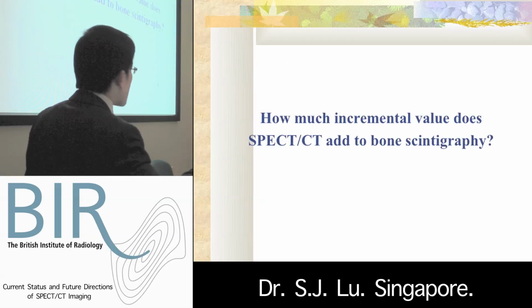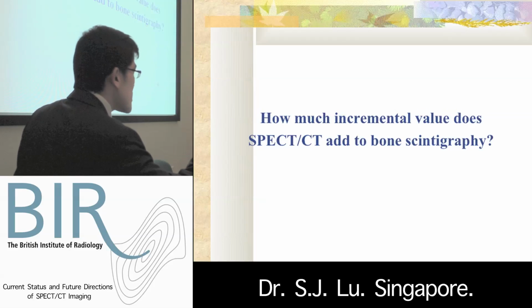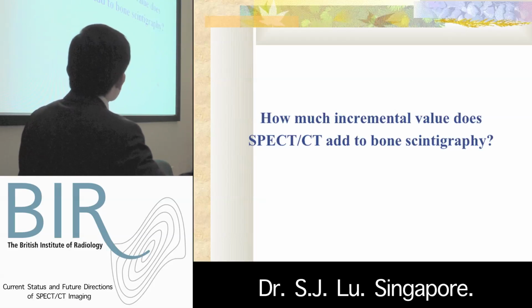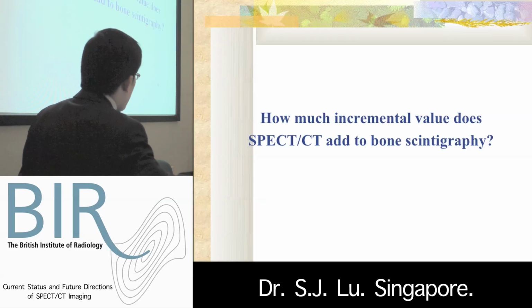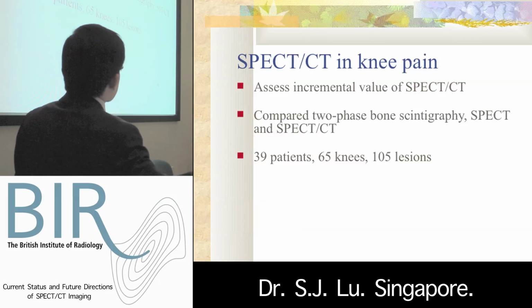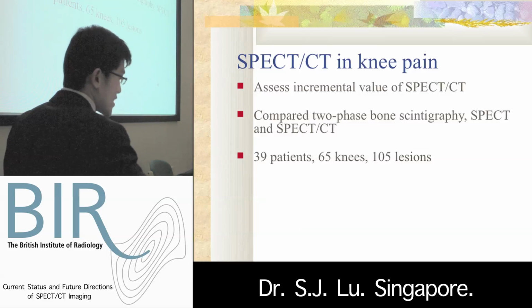So how much incremental value does SPECT-CT add to bone scan? Is it just a little bit? Is it a lot? Is it significant enough to justify the longer scan time and the higher radiation burden? A team from St. Thomas's Hospital assessed the incremental value of SPECT-CT in the assessment of knee pain. Two-phase bone scan was compared with SPECT and SPECT-CT for 39 patients, 65 symptomatic knees, and 105 lesions.